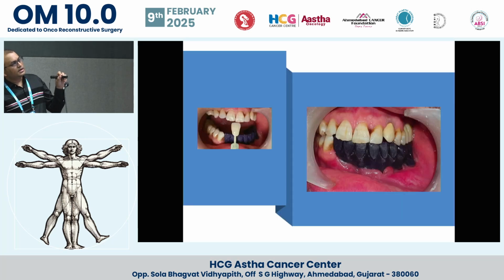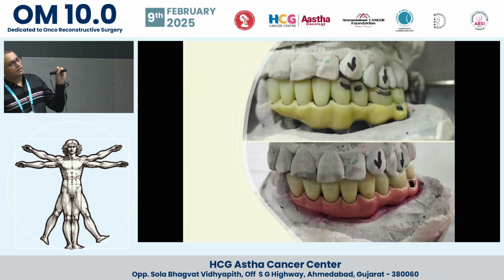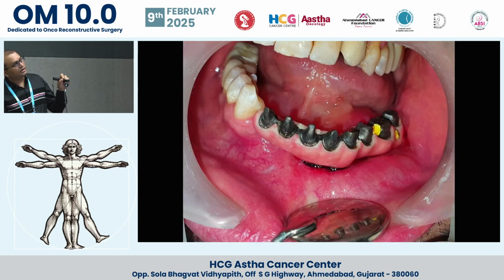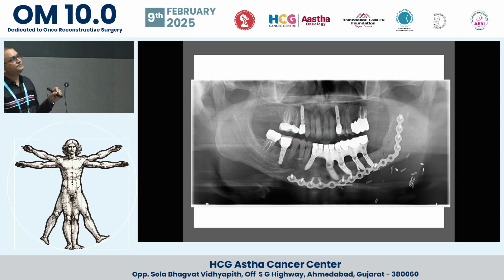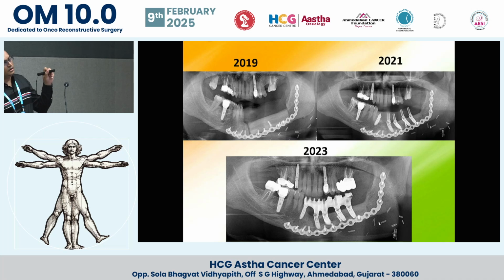And these are the measurement steps: the vertical bite registration, the shade matching. This is in the lab, one piece. This is a titanium framework and individual zirconia crowns, and this is the pink shading given later on. So this is inside the patient's mouth, and individual zirconia teeth will be cemented on top of it, and this is how it looks. So from here to here it is fibula, and these are the artificial teeth. So this is how the X-ray looks, from here till here.